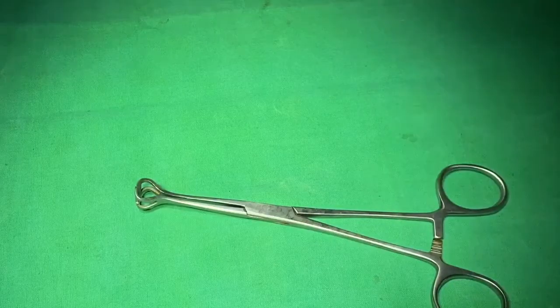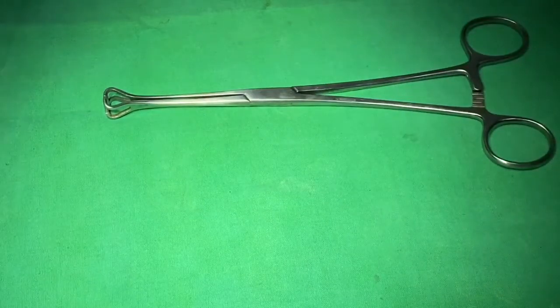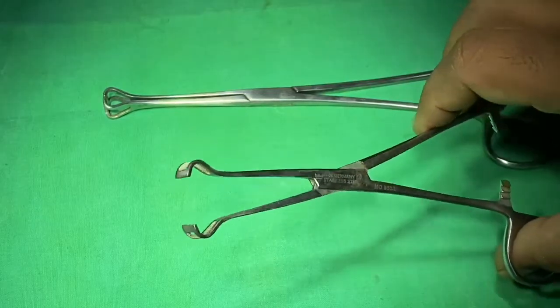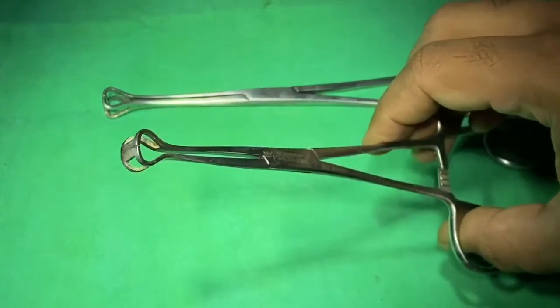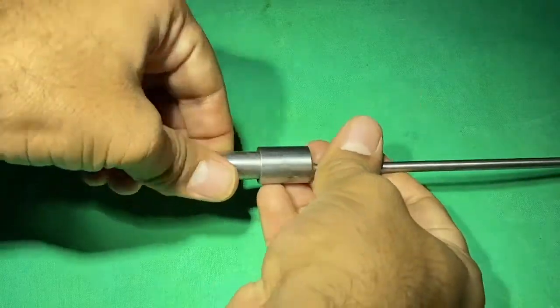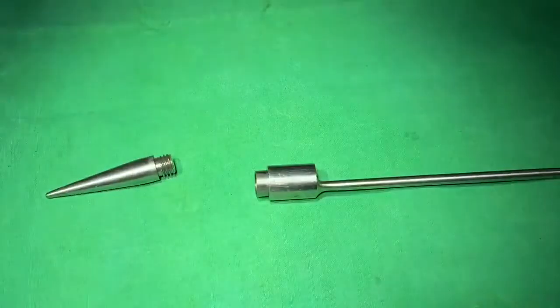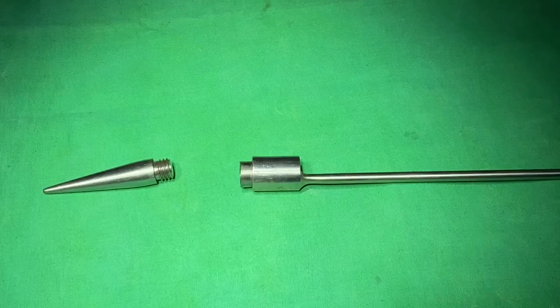This is Babcock's forceps, designed to hold tubular structures like the fallopian tube and appendix. It is less traumatic compared to Alice forceps because its mouth is blunt, not sharp. This is Barron's rubber band applicator, used in surgery for hemorrhoids. The rubber band is loaded onto the upper part of the instrument, the hemorrhoid mass is delivered into the lumen, and the rubber band is fired at the base of the hemorrhoids.